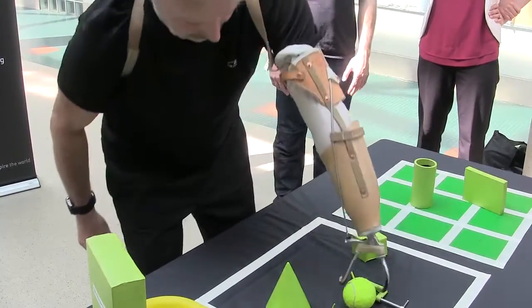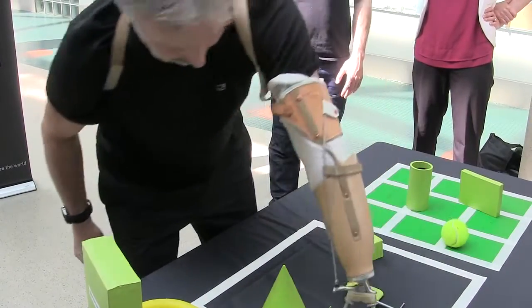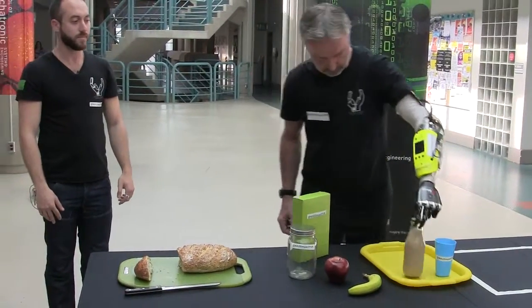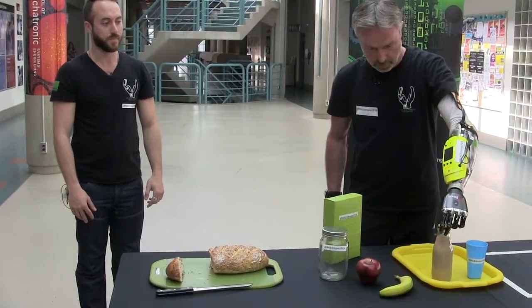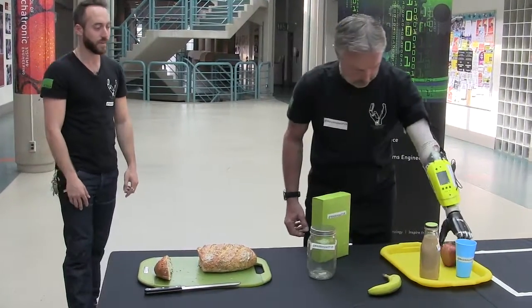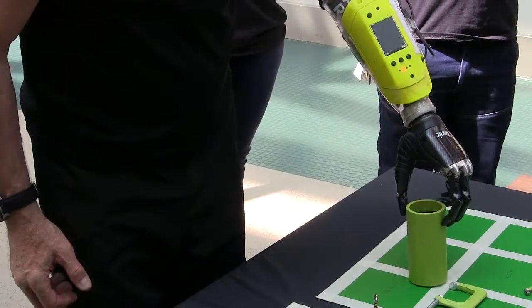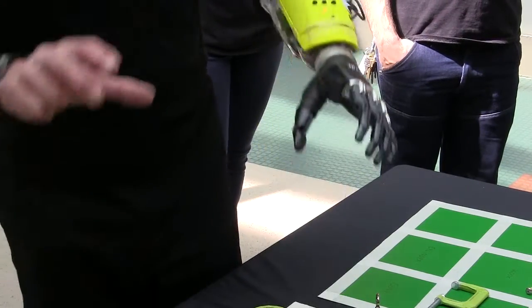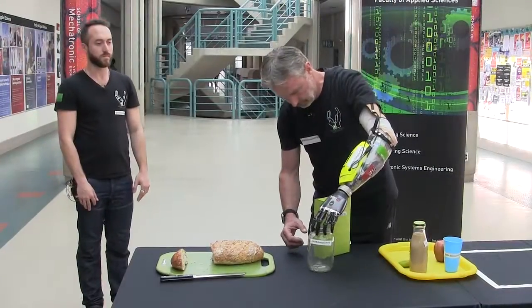Currently, users have to learn how to activate and move their muscles in specific patterns to use their hand. That can take up to many months of training, can become cumbersome to learn, and unfortunately leads to abandonment of these amazing devices that could really assist them. So we're dealing with the bottleneck problem, which is the human-machine interface — we want to make it natural for the user.